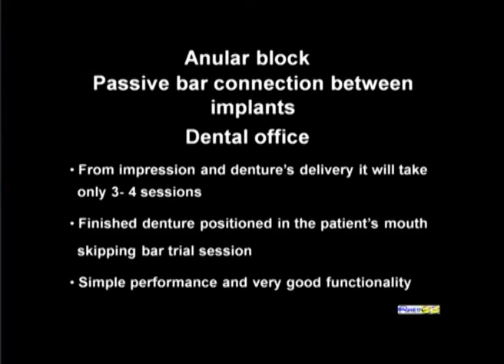Dental office. From impression and denture's delivery, it will take only 3 to 4 sessions. Finished denture positioned in the patient's mouth, skipping bar trial session. Simple performance and very good functionality.